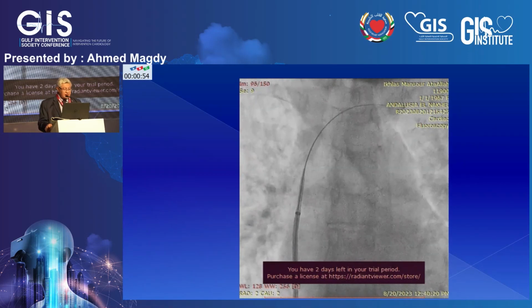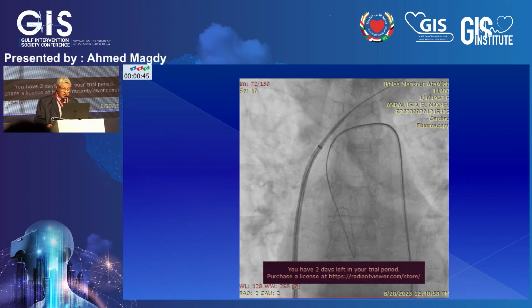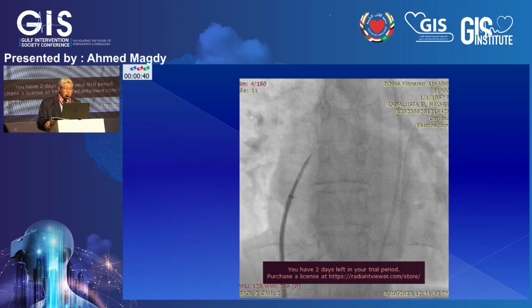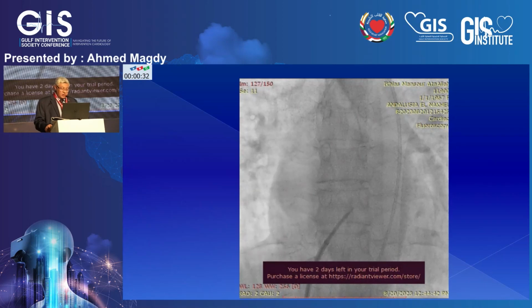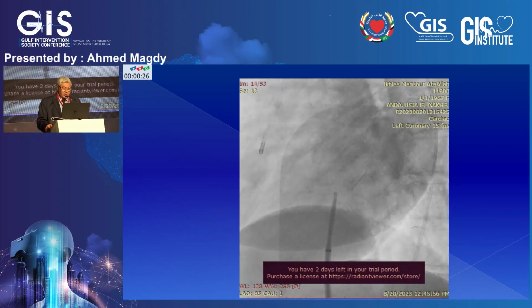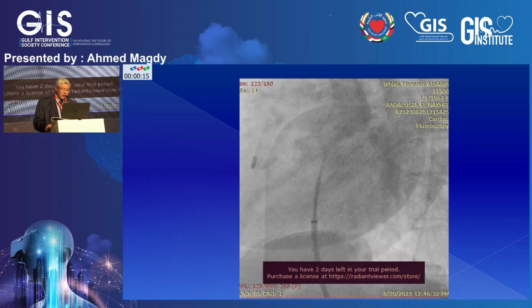And so we did the mitral case as usual. We just ballooned the mitral. Mitral stenosis is not as common as in the old days, but we still have many cases in the heart institute. This is the septal puncture. Then the INOUE wire.